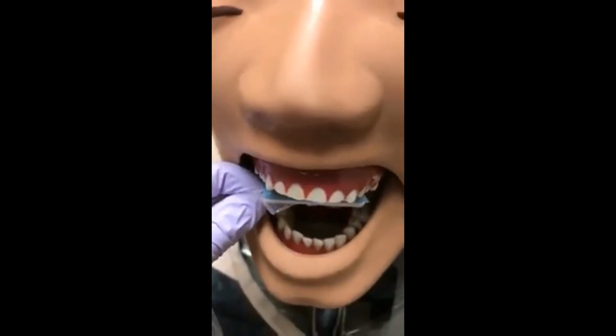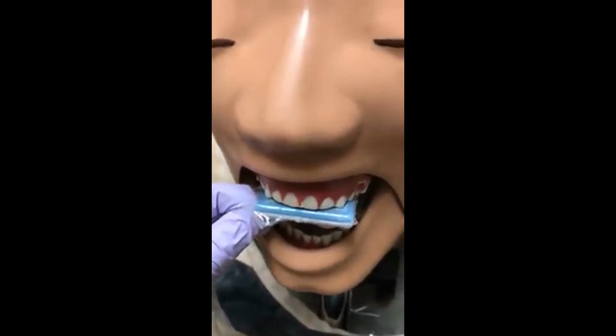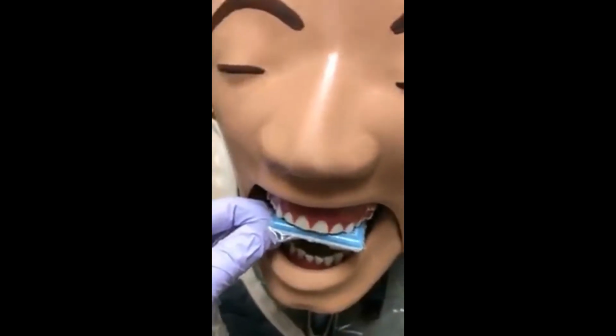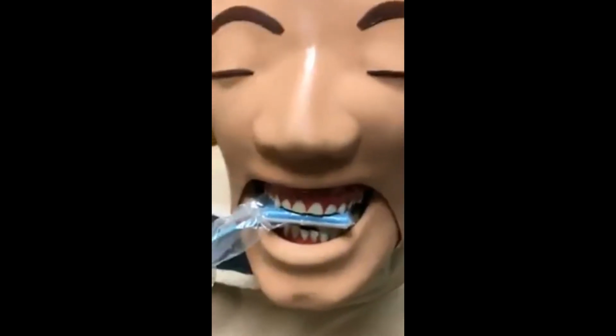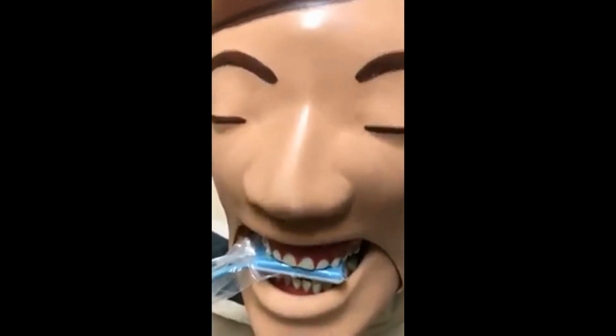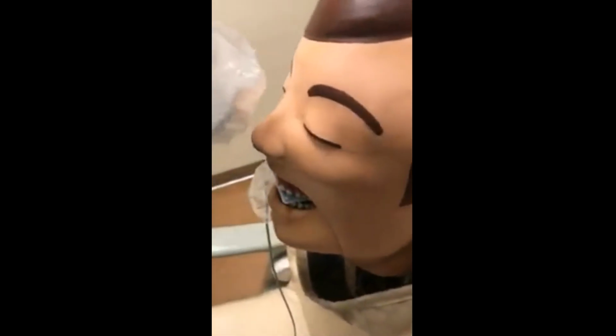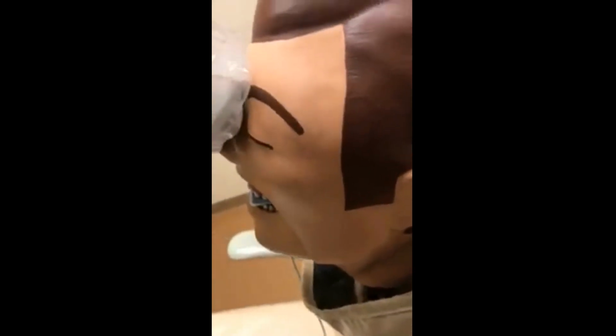Insert the receptor into the patient's mouth, placing it as far posteriorly as the patient's anatomy permits. You can leave the receptor a few millimeters visible, so when you place the PID, it helps to avoid the cone cut. Instruct the patient to bite gently on the receptor, retaining the position of the receptor in an end-to-end bite. Position the PID such that the central ray is directed at a positive 65 degrees vertical angulation towards the center of the receptor.